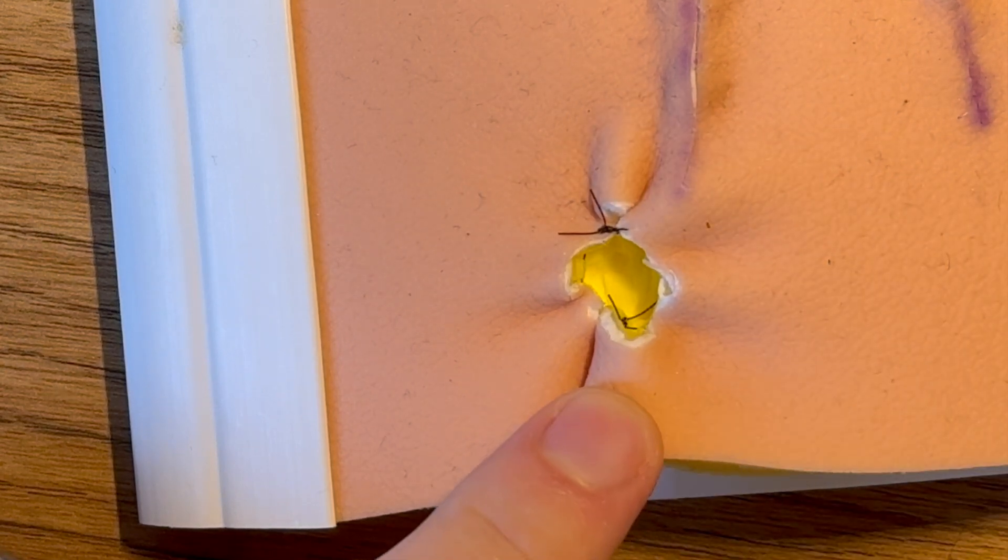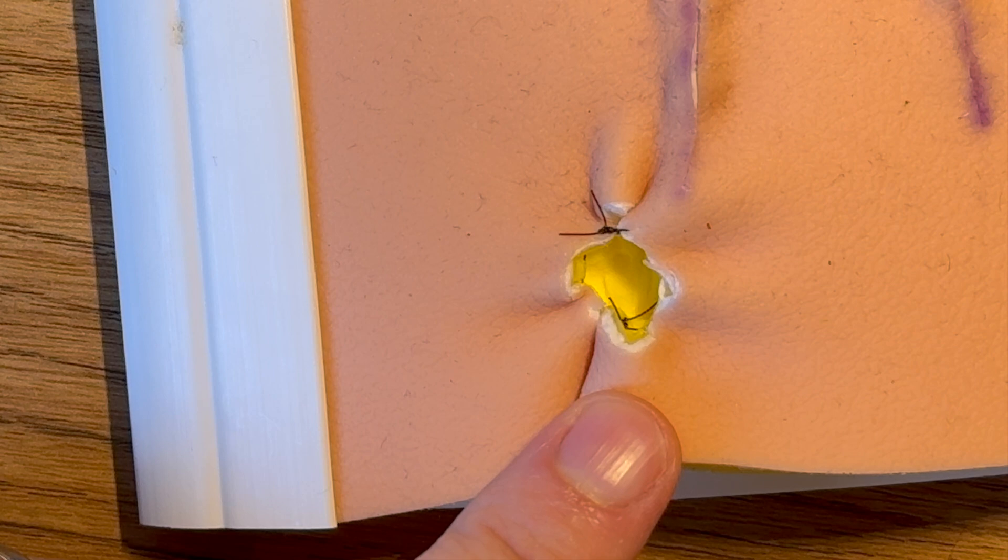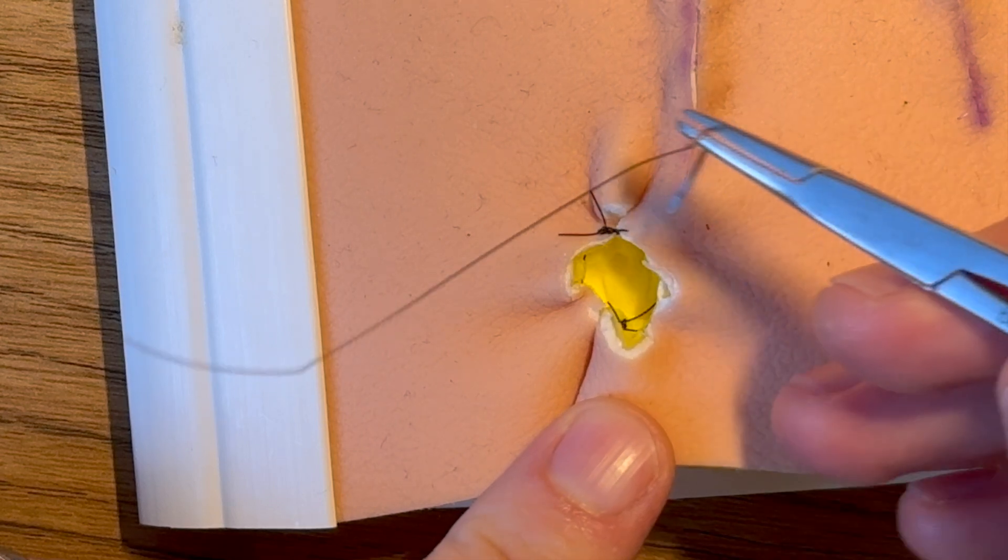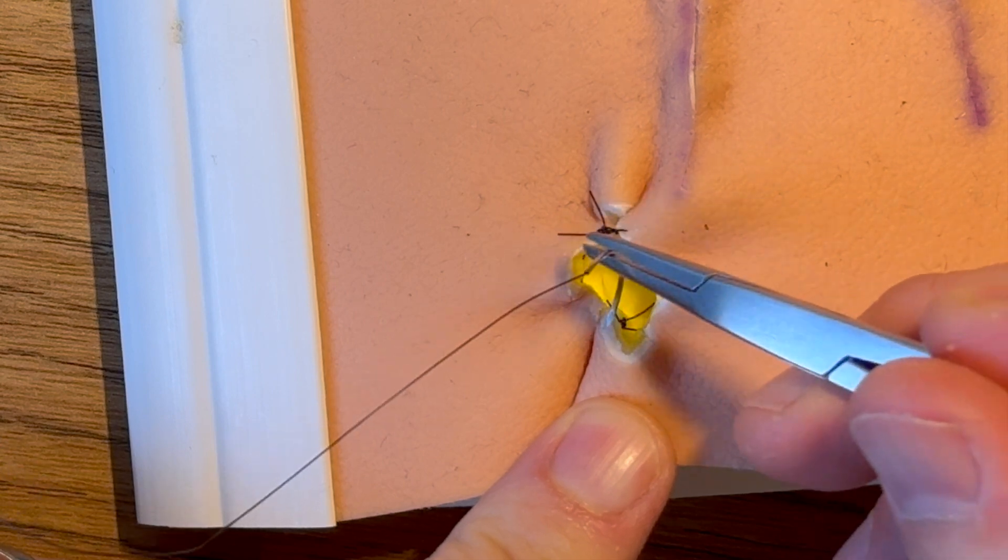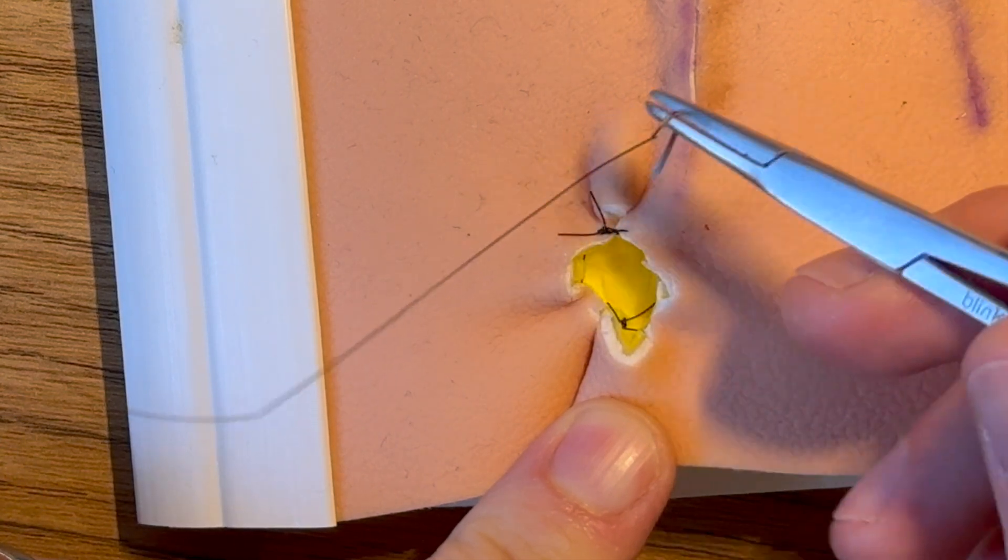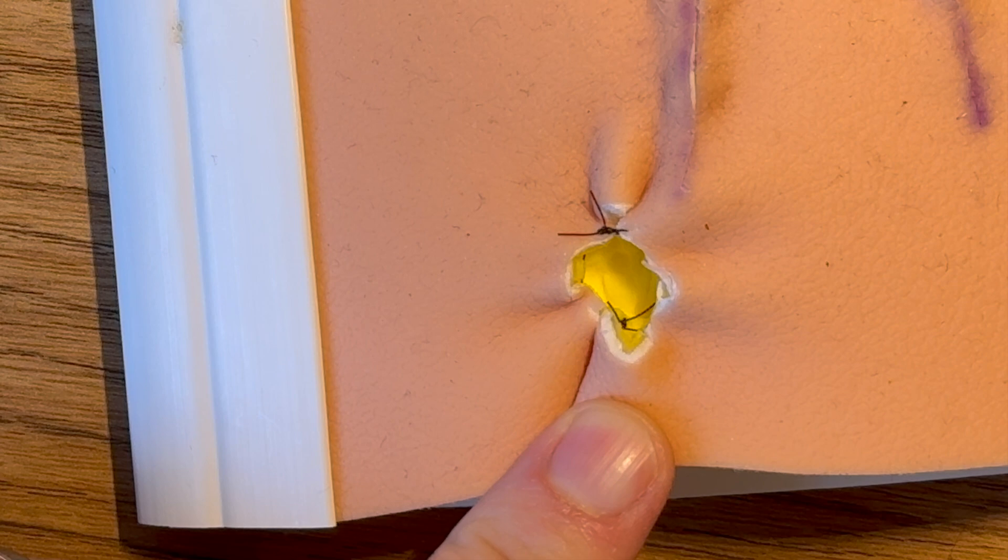Then sometimes this is a very practical thing to do on a scalp or back of the hand as long as it's just a skin lesion and not involving fascia on the back of the hand. And you might do it even on the shin of the leg, the lower leg anterior.